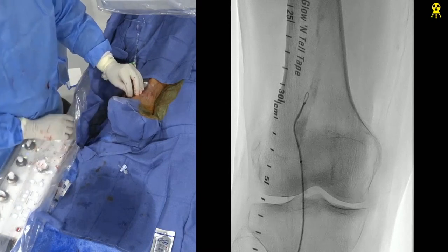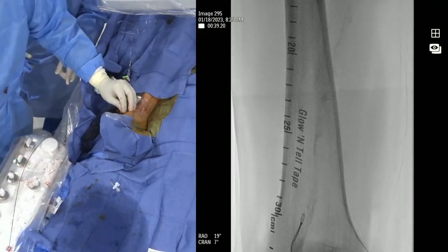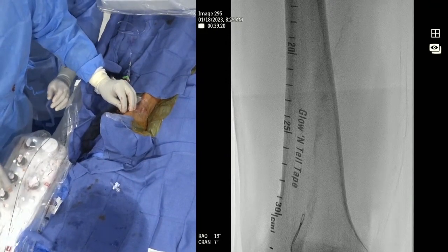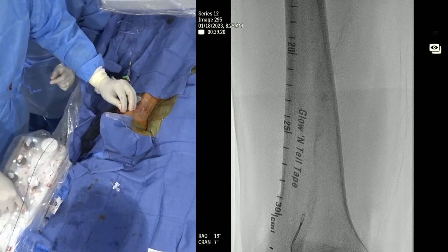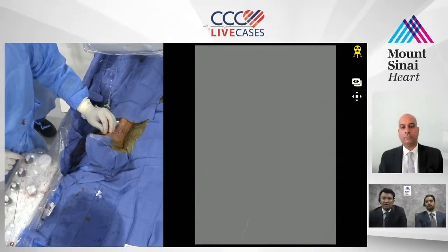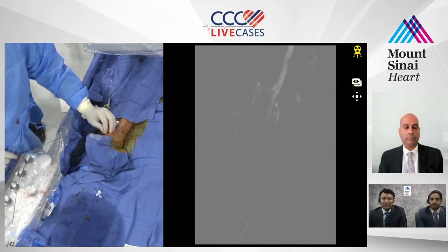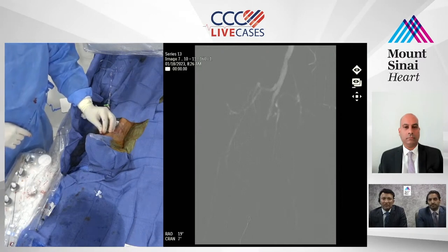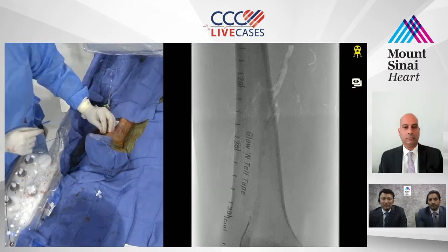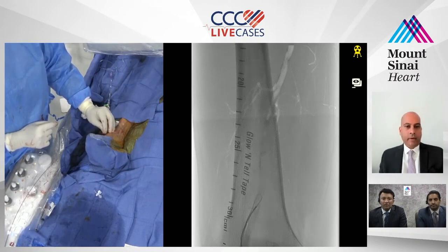But if you know that she's so calcified in the pop and occluded twice, why wouldn't you just consider doing a bypass for her? Fem-pop bypass, you mean going above that plaque? Yeah, just do a common femoral to pop bypass. I think the other consideration is whether she has vein. Especially with her multi-level disease, I would rather save her vein and use it for critical limb ischemia if she progresses. So I would probably just try to fix the inflow first and save her vein, especially for claudication. But I think that's a good point in other cases.